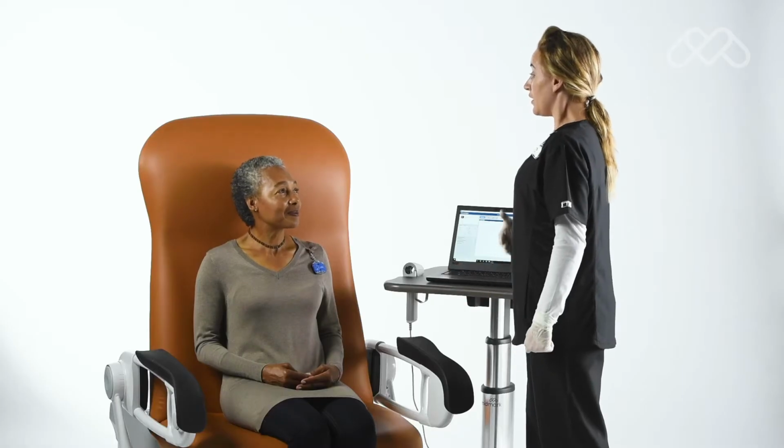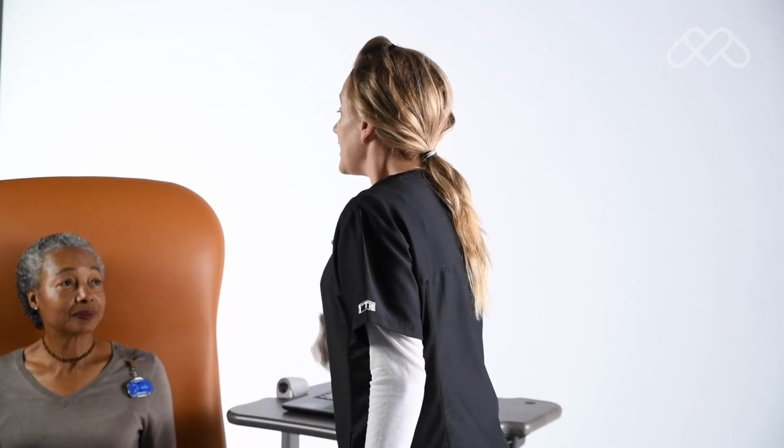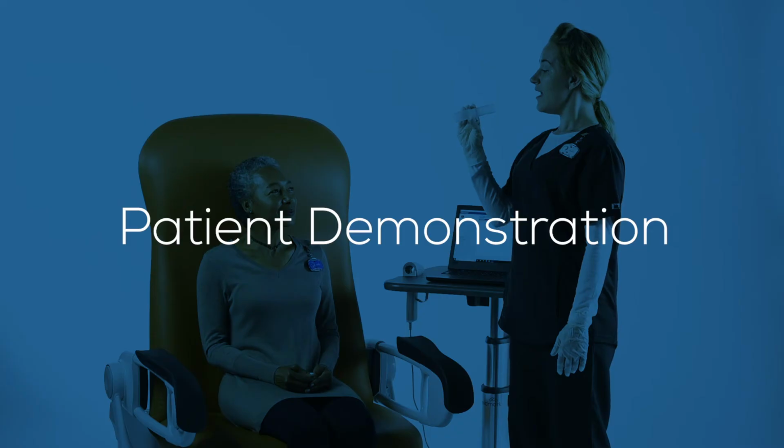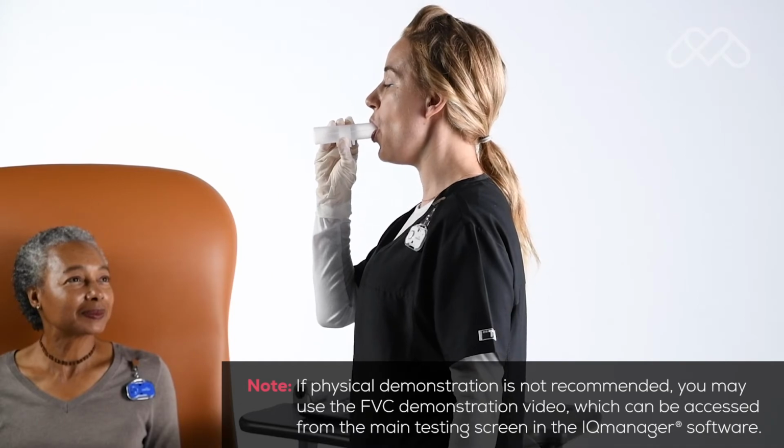Advise the patient that you will be telling them to continue to blast the air out hard and fast. And even when they feel like they have no air left, keep going until told to inhale or stop. After patient instruction is given, it is essential that you demonstrate the correct way to perform the test.